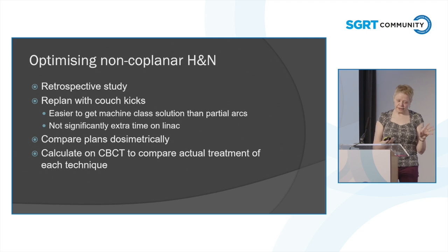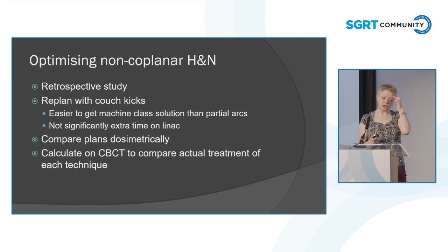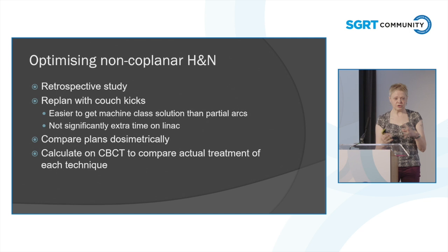So this was the plan, it was going to be a retrospective study. We were going to replan with couch kicks, as I found this was going to be an easier class solution than trying to avoid the shoulders with partial arcs. And then we were going to calculate each one, the coplanar and the non-coplanar, on the cone beam CT to compare what the actual treatment would have been in each case.